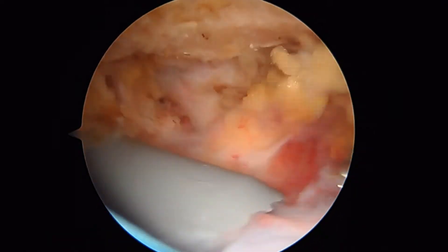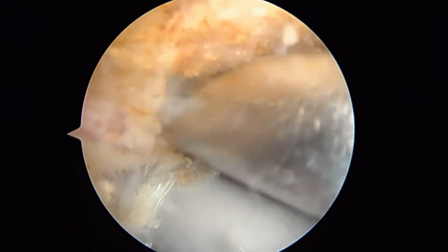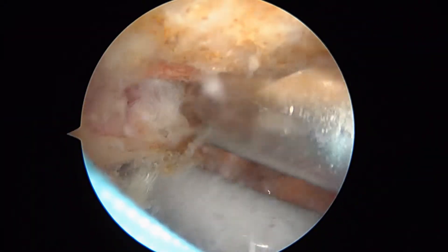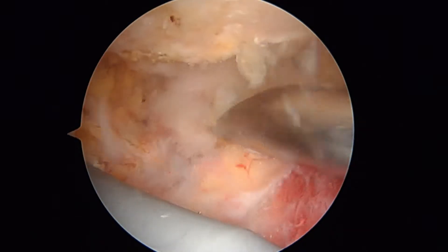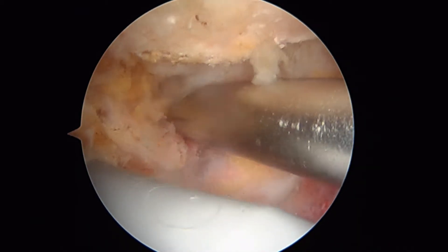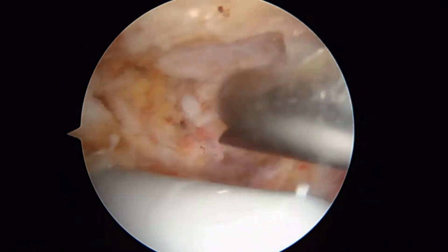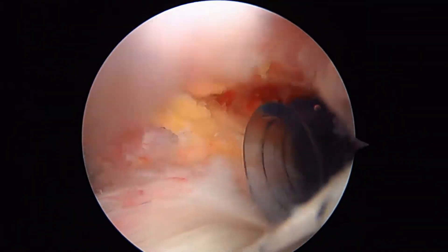We're in the subacromial space now. Anterior is to the left, posterior is to the right. We've got a burr in here just to smooth off the anterior edge of the acromion right here. I've already had a peek at the rotator cuff, so I know the answer to the question. That's the clavicle we're working on there, and what we're doing is just making sure there's plenty of space for the repaired rotator cuff. We're going to put the shaver back on here.